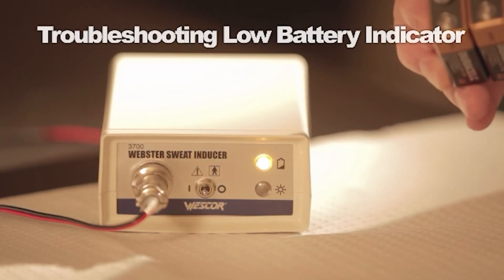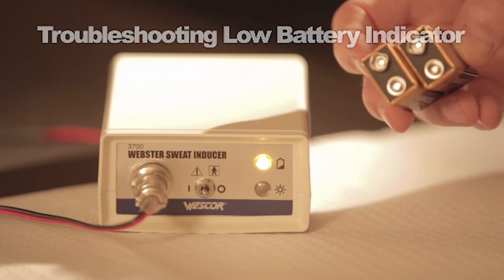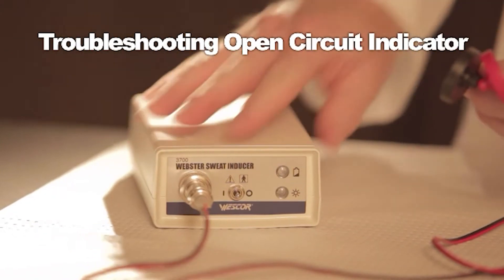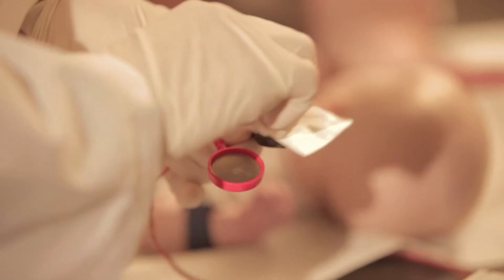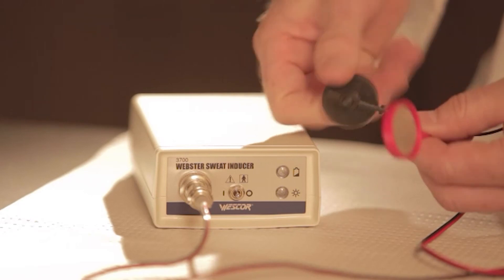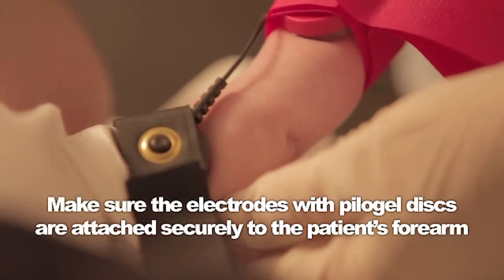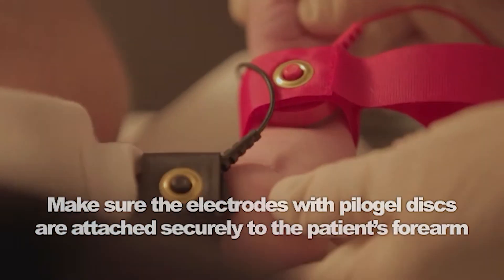When the batteries are low, the low battery light comes on and an alarm sounds when the switch is pushed to run. There is a built-in open circuit alarm that sounds when current is not able to flow between each electrode. Make sure the electrodes are clean and unmarked; if necessary, clean or replace them. Make sure electrodes are strapped securely to the patient's forearm. Refer to the manual for more troubleshooting procedures.